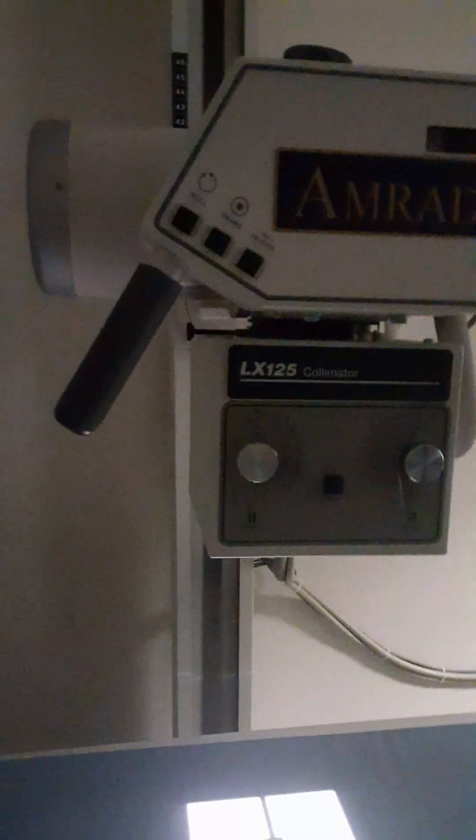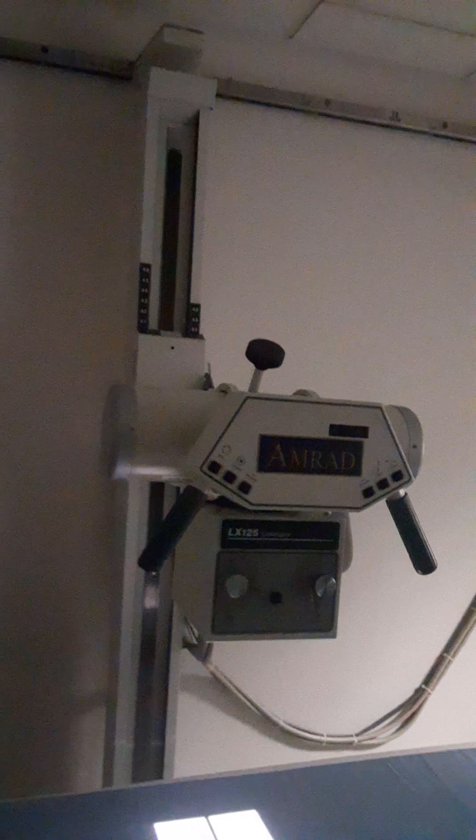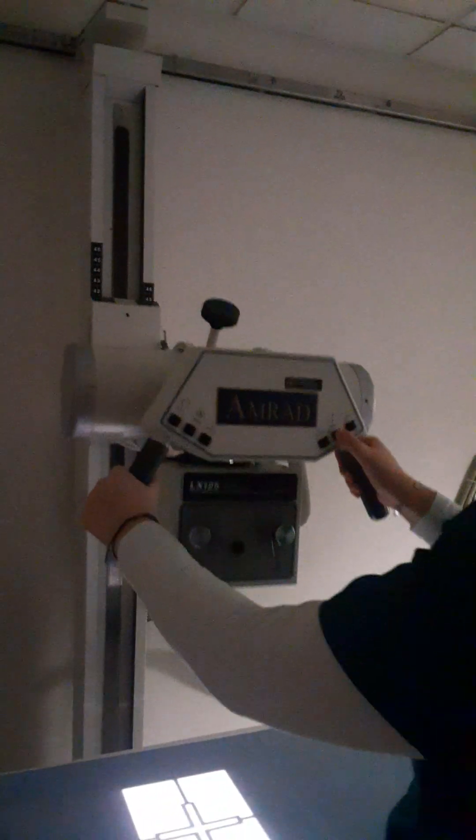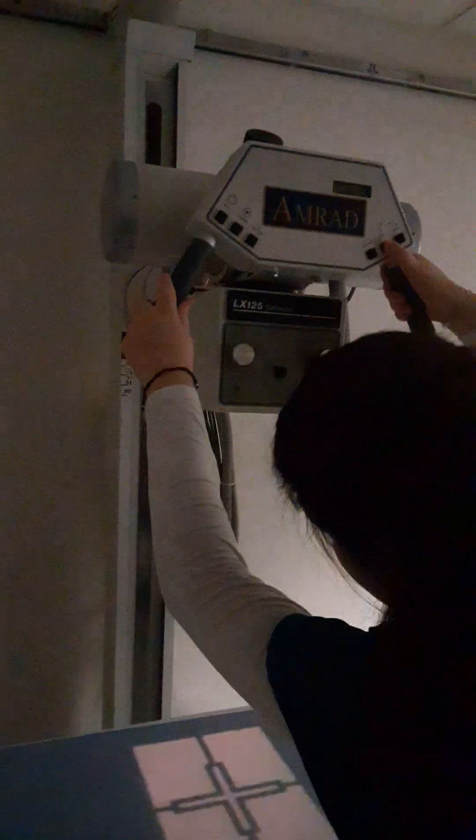We want this tube to be going up and down so that we have it at 40 inches to the table bucky, which is the numbers on the right. Again, we're going to look at that line over here, 40 inches.